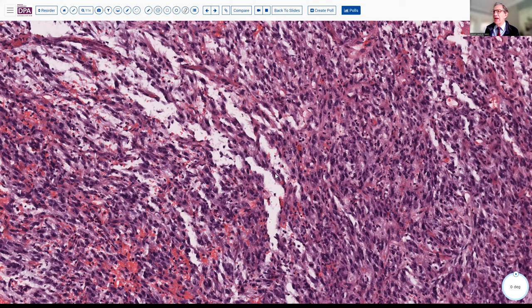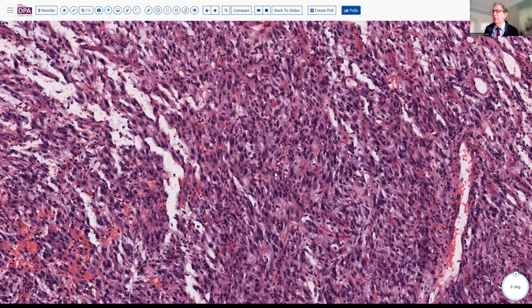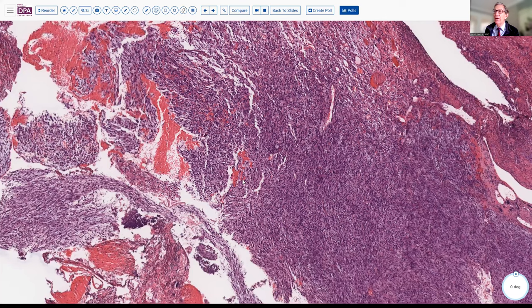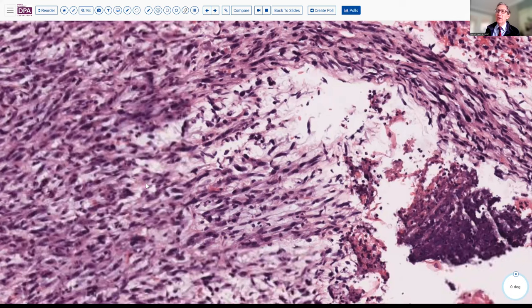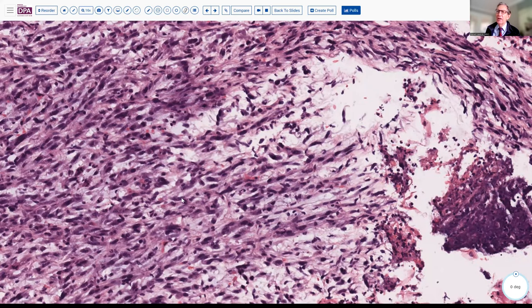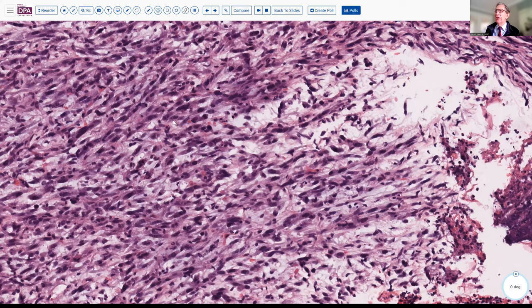This is certainly concerning for a mesenchymal neoplasm, a spindle cell proliferation probably related to a sarcoma, and it doesn't have the appearance of our usual low-grade type of sarcomas. We'll appreciate that there's a degree of myxoid change in a few areas, with some intervening loose, slightly myxoid tissue. We also see nuclear enlargement and hyperchromasia, a lot of apoptosis, and single-cell necrosis.